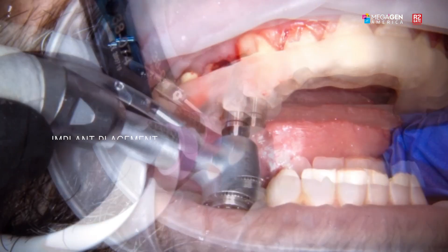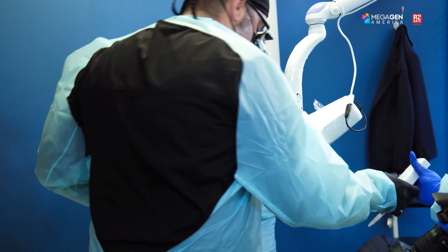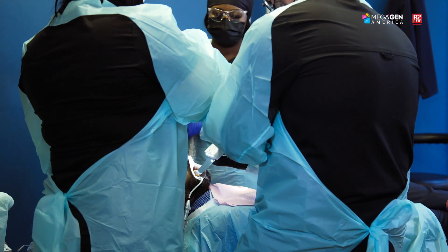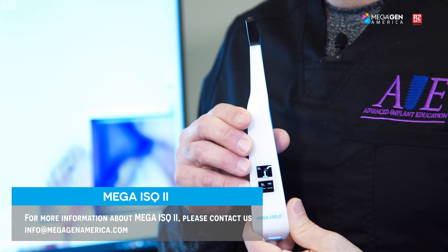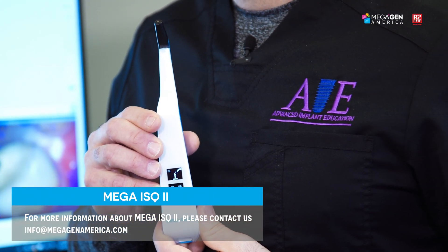A fundamental part of implant placement, especially immediate implants, is receiving an ISQ value. An ISQ value above 70 means there is a very good chance of being able to load an implant the same day. ISQ is the only objective value we can achieve to determine implant stability. The new MEG ISQ 2 provides a portable, lightweight option with a color-coding system to let us know when we've achieved the correct value. That's the new MEG ISQ 2 by Megagen and Osstell.